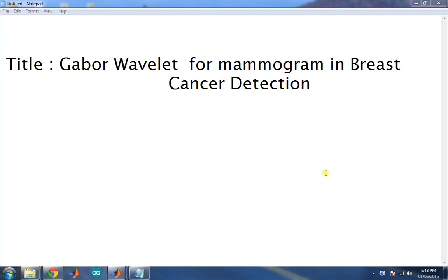Hello everyone, this is the demonstration for Gabor wavelet for mammogram in breast cancer detection. We will see the demonstration in MATLAB 2013.